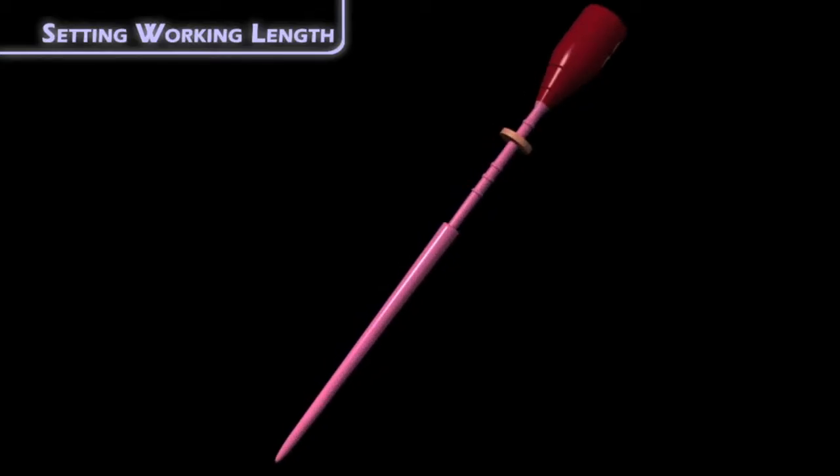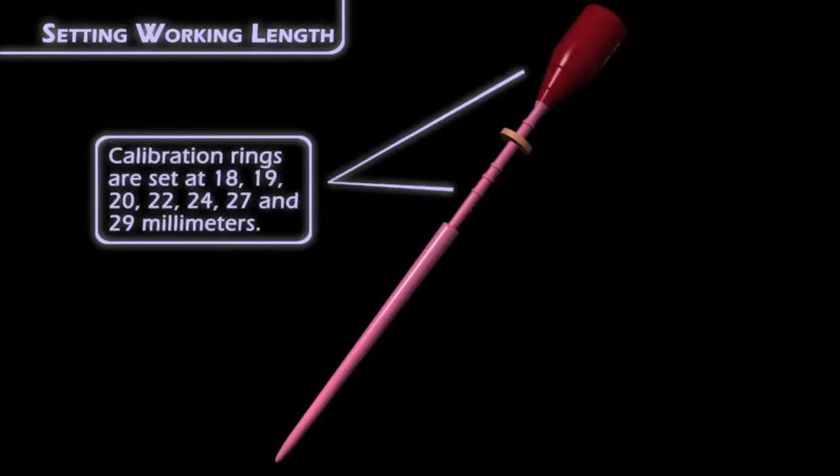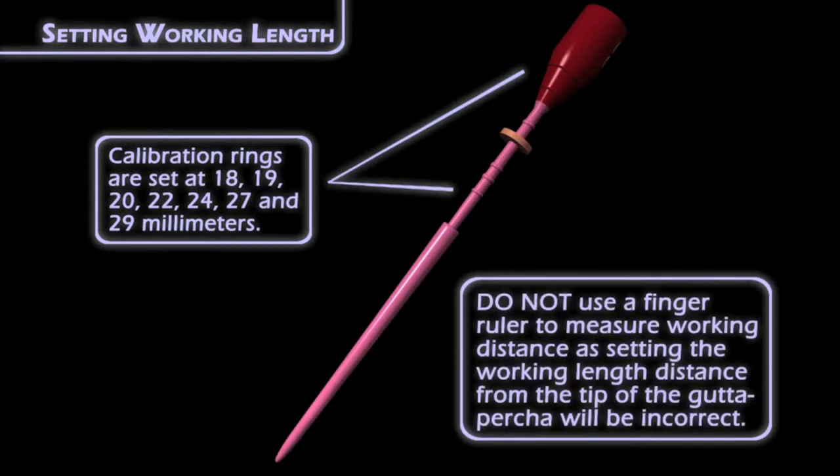There are calibration rings at every level of the carrier, above the level of the gutta percha, at 18, 19, 20, 22, 24, 27, and 29 millimeters. So for the really long ones, you can use those rings to help you figure out where you want to place this.